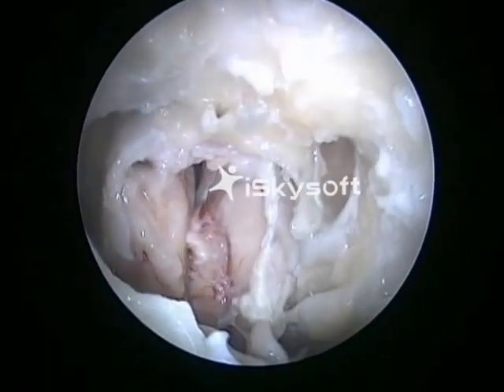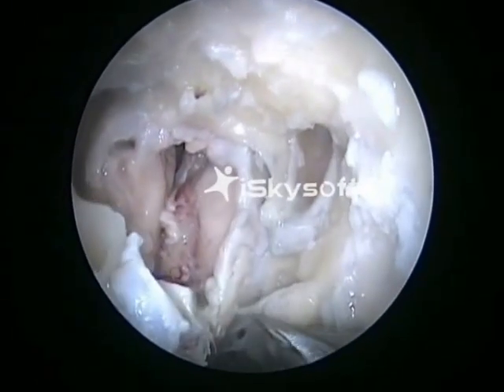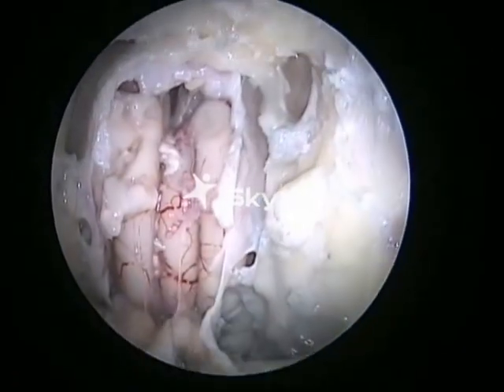And now we can see the olfactory tract. In fact, we're cutting the dura now. We can see the olfactory tracts on both sides. The gyrus rectus is seen very clearly.